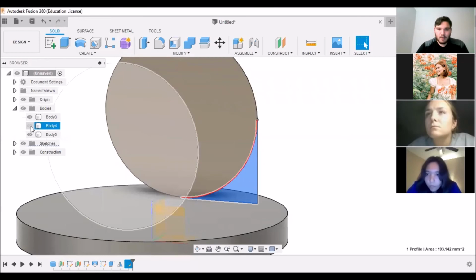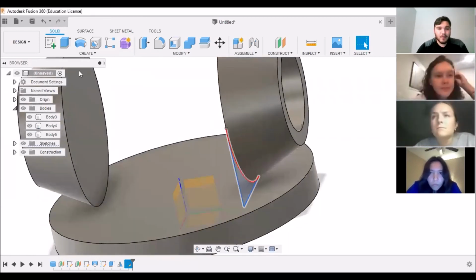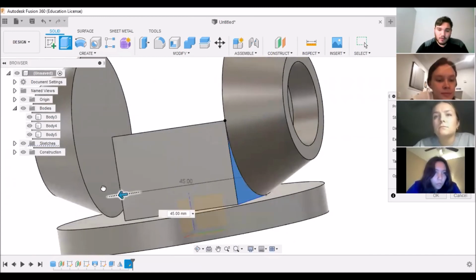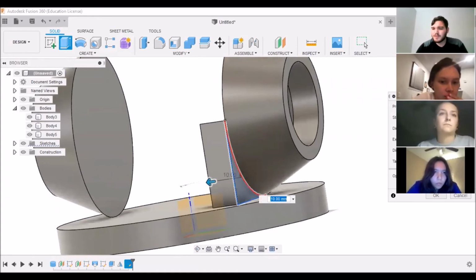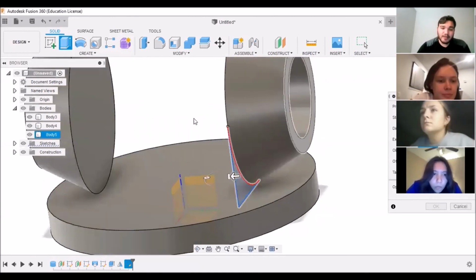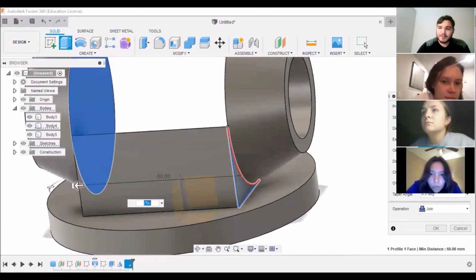Okay. So we can bring back the cap body again. And now we're going to connect these two by hitting the extrude button. And instead of just dragging from one face to another, something we can do is on the right panel, instead of distance, click that drop down and go to object. Once you're at to object, you can just select the back of the face and it immediately drags there. And so that's really helpful.